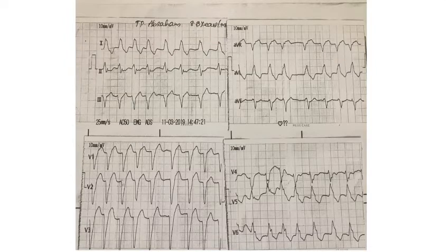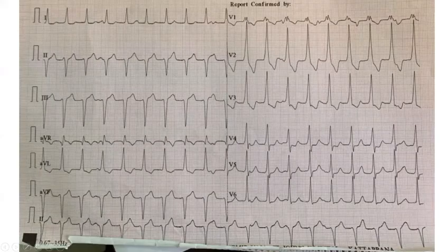Sir, atrial fibrillation, left bundle branch block. Because sometimes when this type of ECG is shown, it is a broad QRS complex, and people jump to say it is a ventricular tachycardia because you are not seeing P waves, you are seeing broad QRS. You should scan the whole ECG, and you can easily see that it's quite irregular, indicating that this is a case of atrial fibrillation with existing left bundle branch block. Very good. Okay, now this one.